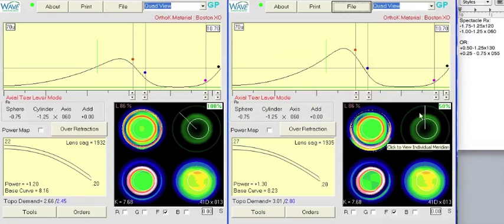Now, the lens will hopefully orient to a particular direction and keep everything the way we want it to, but then again, we consider that this is a lens that is worn while the patient is sleeping, and most patients are not sleeping in an upright position where gravity pulls the prism ballast straight down. So what happens if the patient lies down on his side or her side? Is the prism ballast going to shift under the closed eye to a horizontal position?